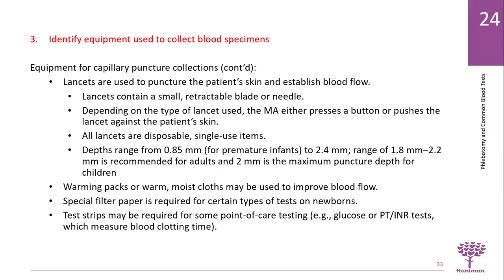Warming packs, as we mentioned earlier, can help improve blood flow. Special filter paper is required for certain types of tests.